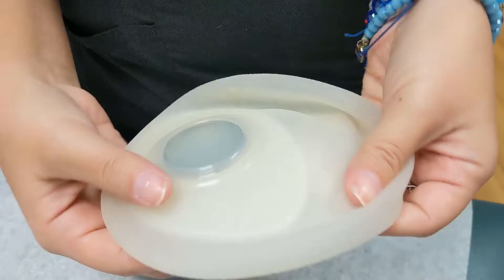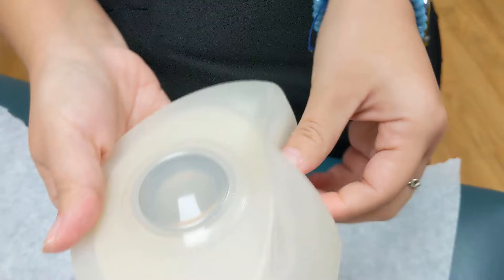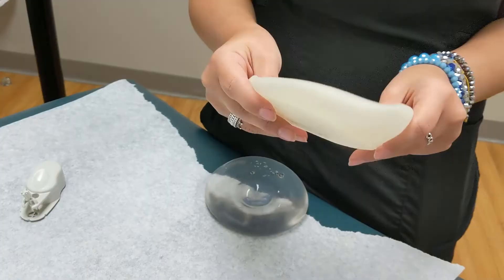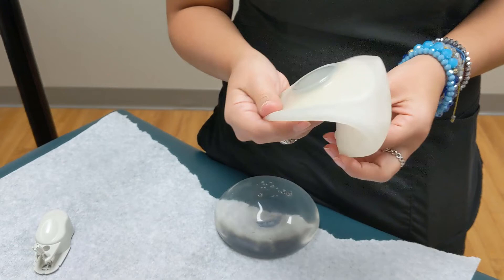This is what you have right now in your breast — it's the tissue expander. This one is deflated. That's the port we're going to use to inflate it — either with air or with saline. We'll use this little magnet to help find the port, then the doctor will mark an X and go through there to start expanding it. Every session you'll go home and evaluate whether you like that size. Once you're satisfied and comfortable, you tell us, and then we'll start planning surgery to exchange it to a soft silicone implant.